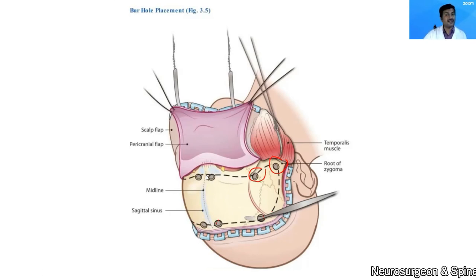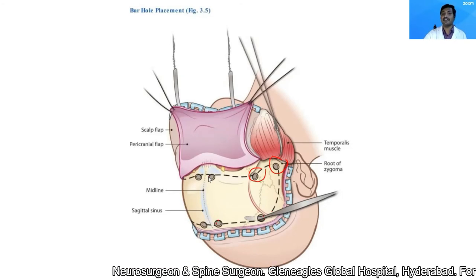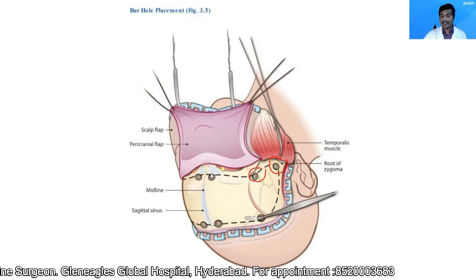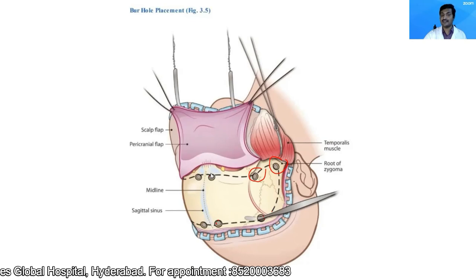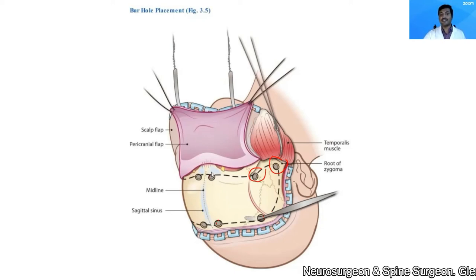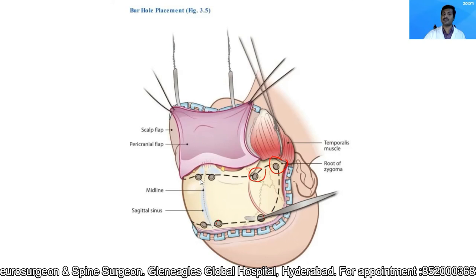These two burr holes may enter into the frontal sinus. If they do, immediately remove the mucosa from the frontal sinuses and pack the frontal sinus with muscle, or fat, and betadine-soaked gauze. All instruments that have entered the frontal sinus should be discarded, and you can start using a new set of instruments.